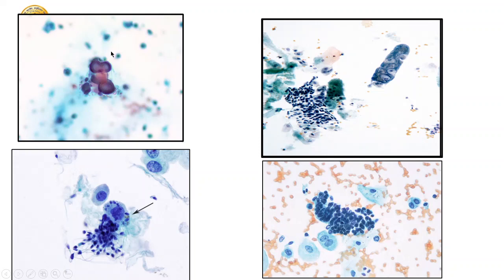Just a few images: this is a specimen from a seminal vesicle — you can see the yellowish lipofuscin pigment. This is a renal tubular epithelial cast, and these are some glandular cells — possibly from a male — and you can see some umbrella cells here. These are possibly some benign glandular cells and origin could not be ascertained.